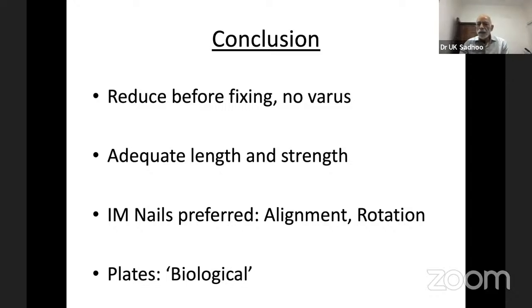Take a sharp guide pin or a thick K wire, make a hole, and then ensure that you hammer it in, it stays in, and your guide wire exactly follows that. You have to confirm and reconfirm it, not only in AP but in lateral position also. You should not be too anterior with your entry point, because the femur has an anterolateral curve. If you put a nail from too anterior a portion, the distal portion of the nail might actually hit the anterolateral cortex.